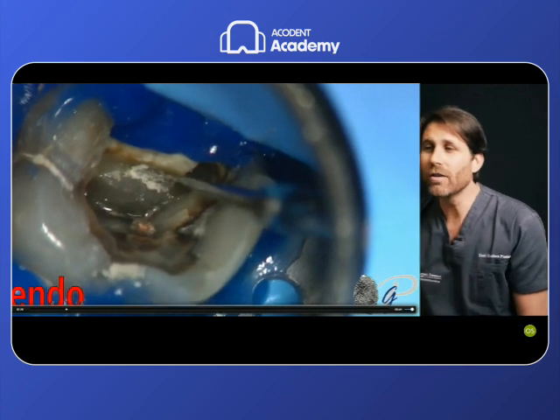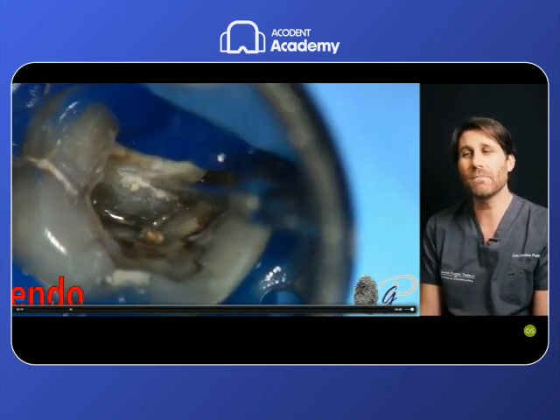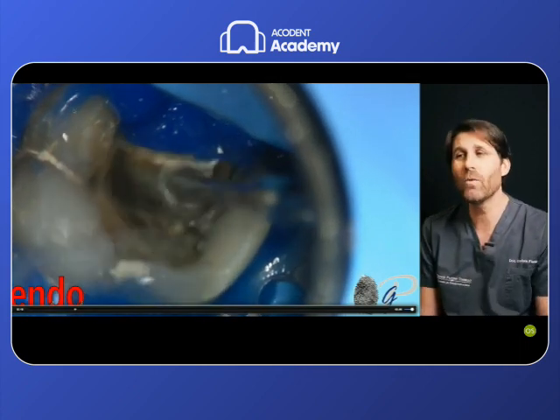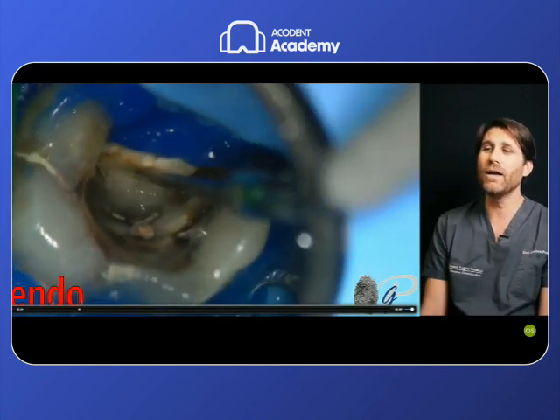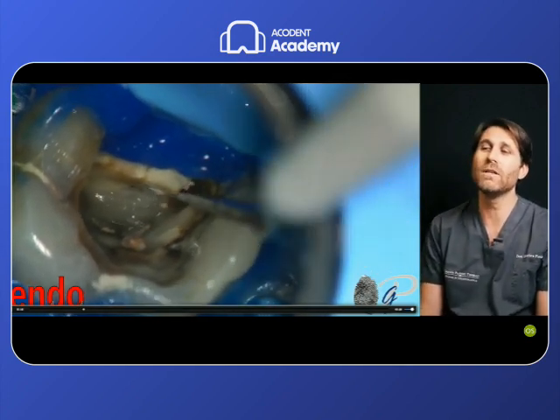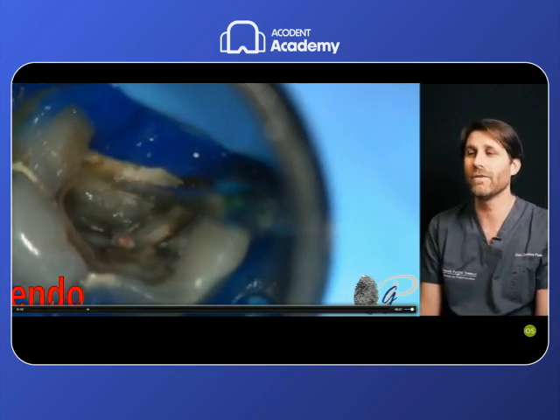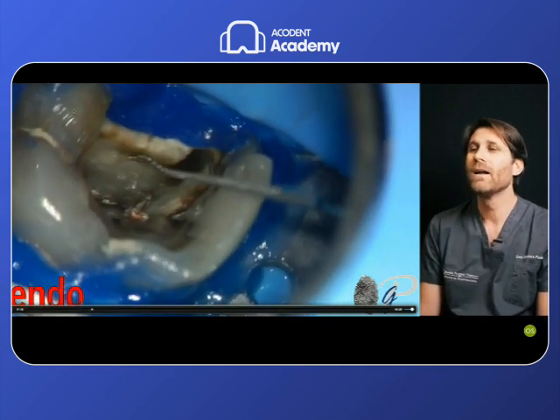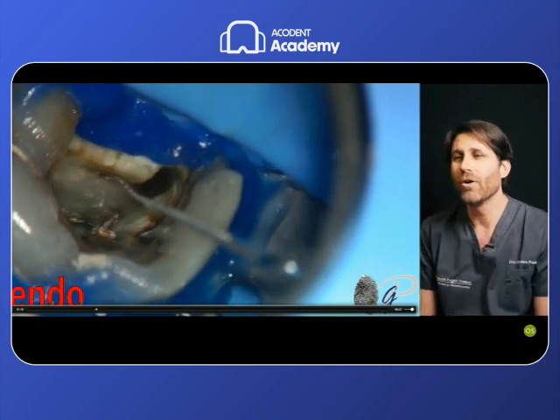First choice is to use again a little bit of ultrasonics to go a little bit deeper, to remove a little bit more discalcified tissue. In these cases, nothing works, so we have to remove more tissue deeper in the root. And I use the ultrasonics to perform this. You can activate water if in the moment you don't need to see perfectly what you are doing, so you remove the dentin powder and the dentin dust, going through the isthmus, looking for that black spot at the end of the isthmus that is the orifice of the root canal.